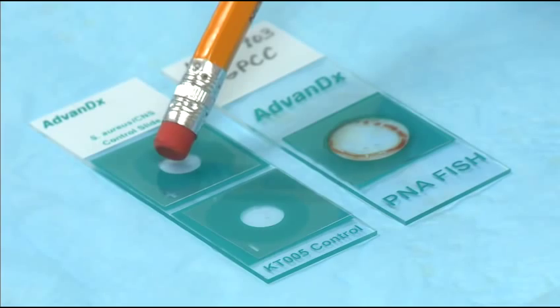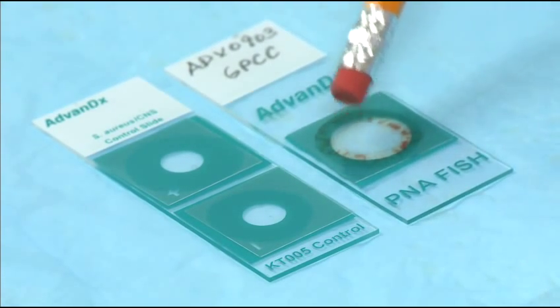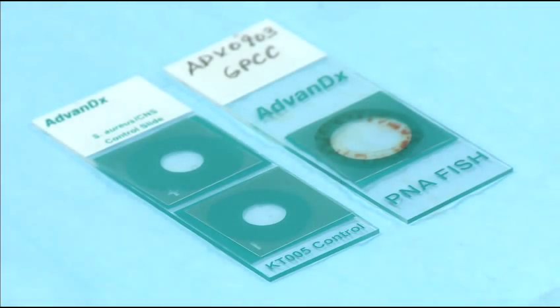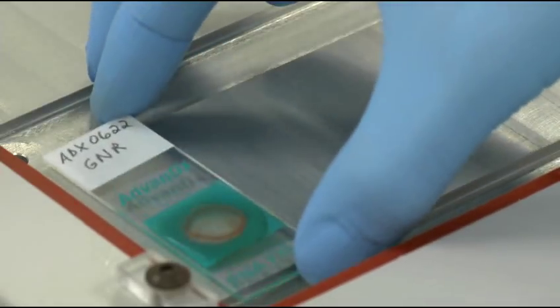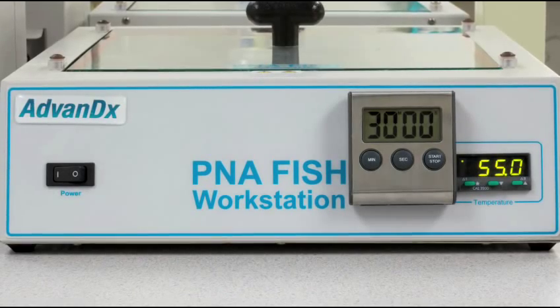Press firmly on the cover slips to ensure even coverage of the well and to remove any air bubbles. Place slides on the PNAFISH workstation and hybridize at 55 degrees for 30 minutes.